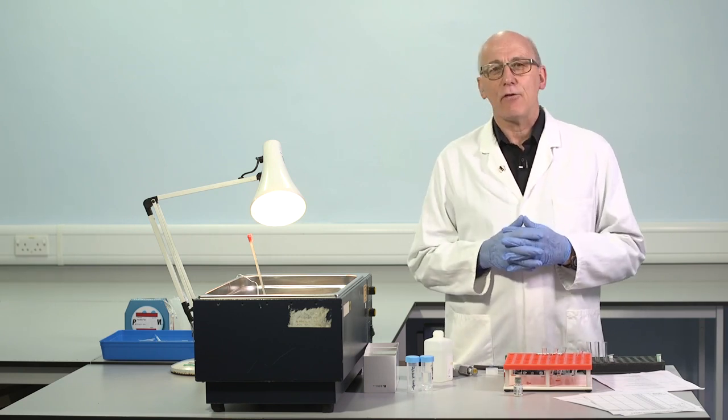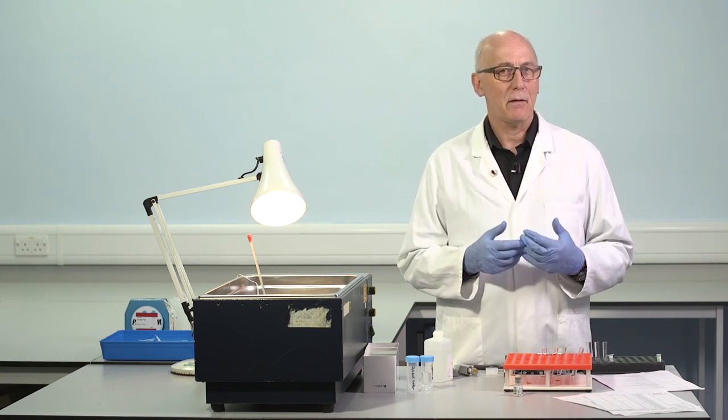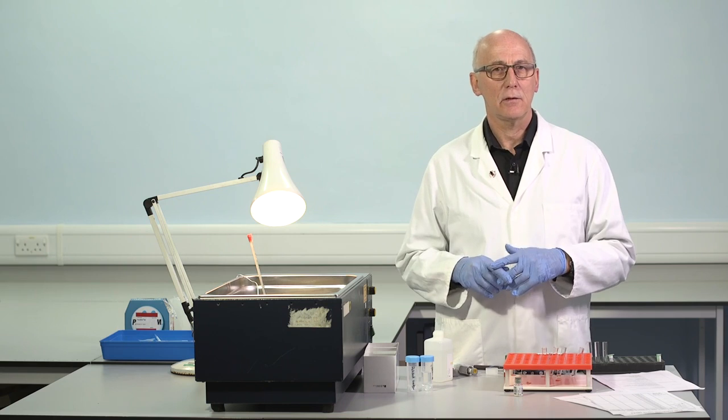So if the residual factor VIII at the end of 2 hours is close to 100%, it means there has been no additional loss. No antibodies present. 100% residual, 0 inhibitor.